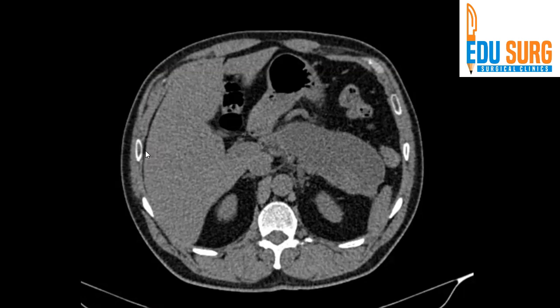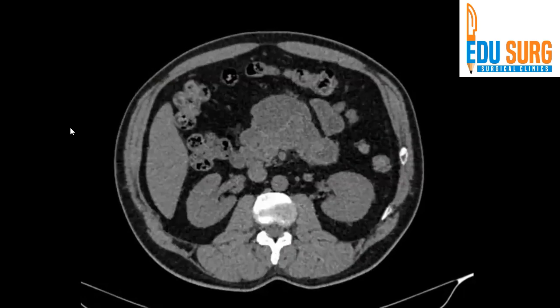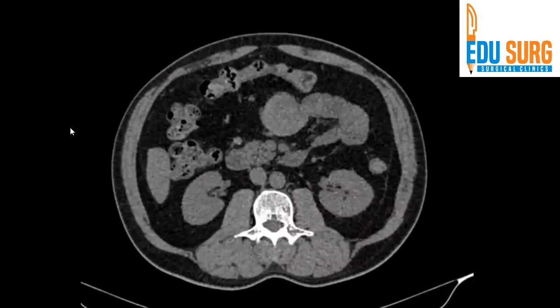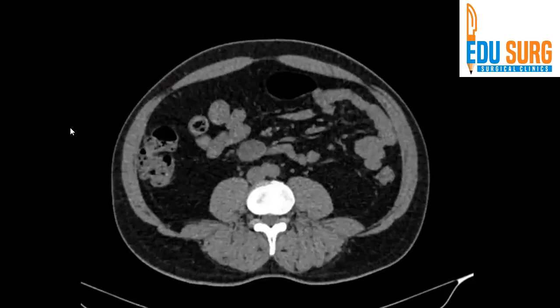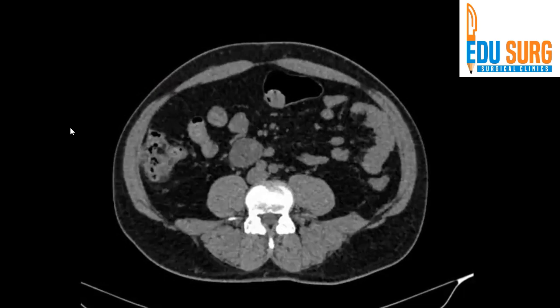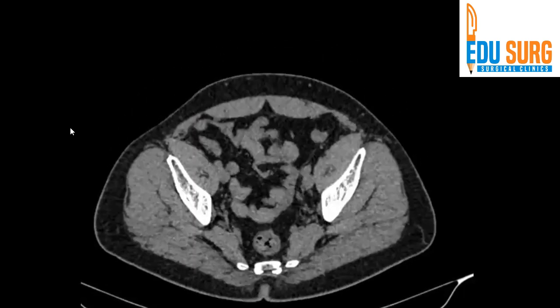Hello everyone and welcome back to our console. I am Dr. Gunjan Desai and today we will see one more interesting abdominal CT scan. Like always, we will scroll through the CT first. You can identify the phases, the views, what section we are looking at, and what are the findings.